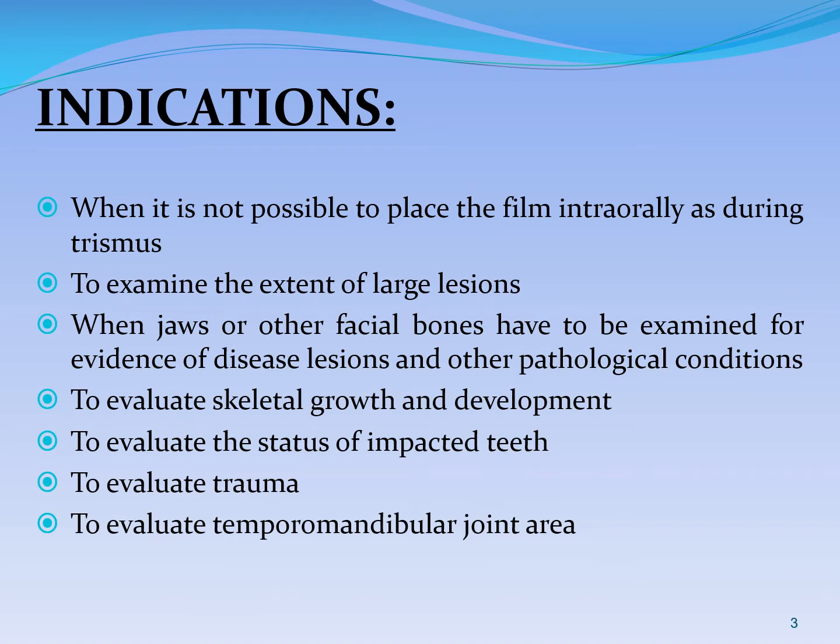Indications are whenever intraoral film radiography is not possible, when the extent of the lesion is large, when the facial bones and the jaws have to be studied to see the evidence of any disease or pathological condition, to evaluate skeletal growth and development, and to evaluate the status of impacted teeth, trauma, and the temporomandibular joint areas.